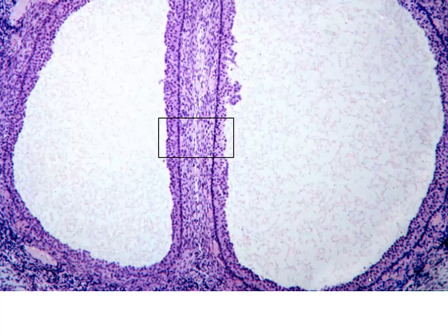Here we have examples of follicles quite easily on the right. We can see the detachment of our granulosal cells, some deep, dark, small spots. These are going to be our atretic follicles, and these are our pycnotic nuclei that are present here. Over here we can see a little bit of detachment. This one is a little bit further along, but we either have an atretic follicle or we have a follicle where we have the oocyte out of the plane of section.